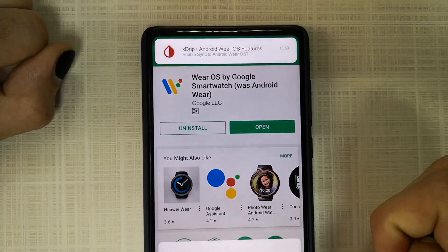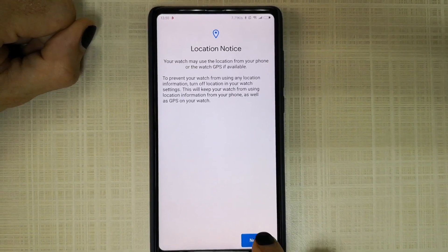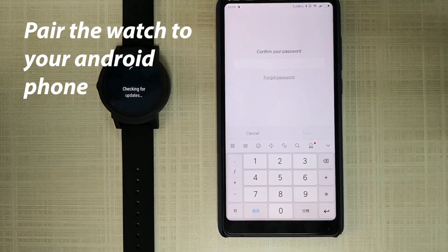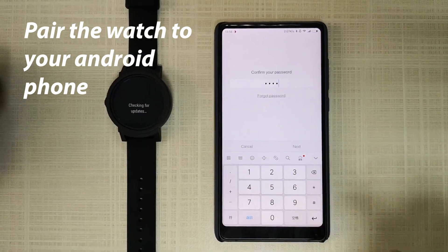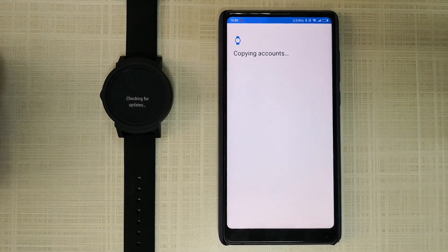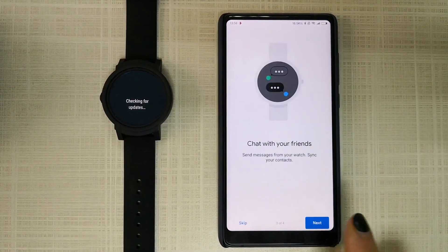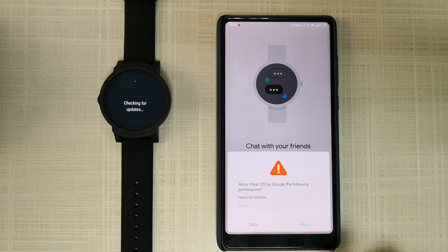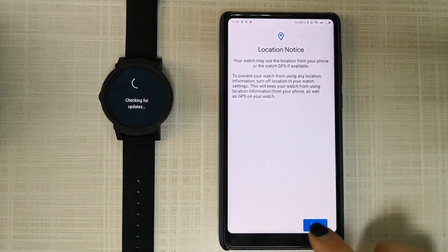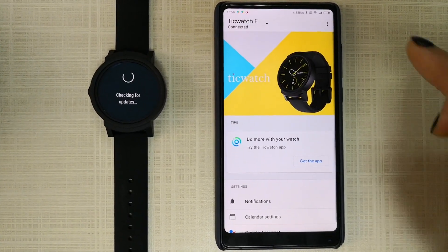After that, open the Android Wear app on your phone and allow it. Press next, type your password, then enter. Copy your apps to the watch — press copy. Now we will copy all your apps to the watch. Connect, then allow all permissions on the watch.